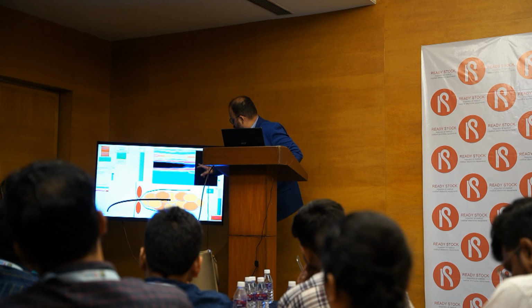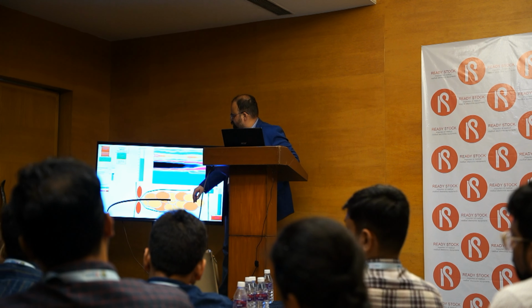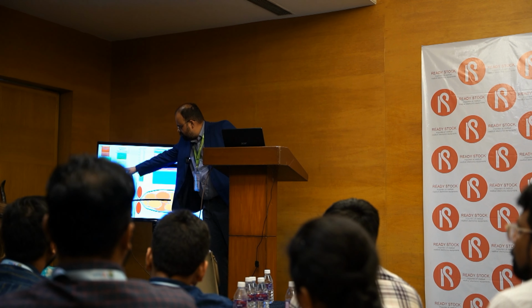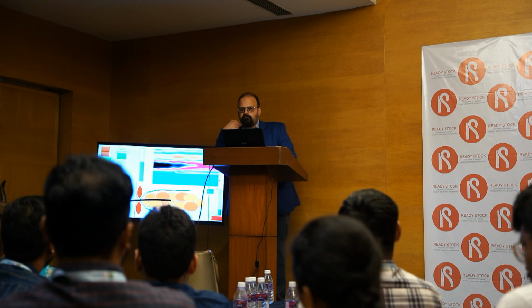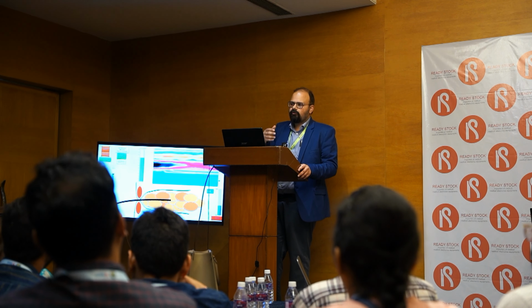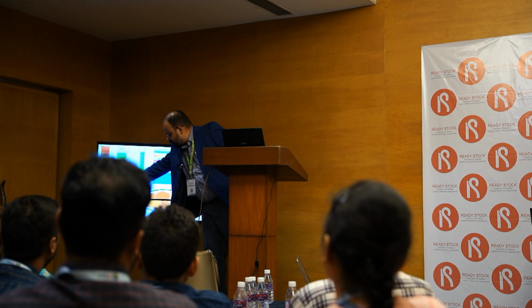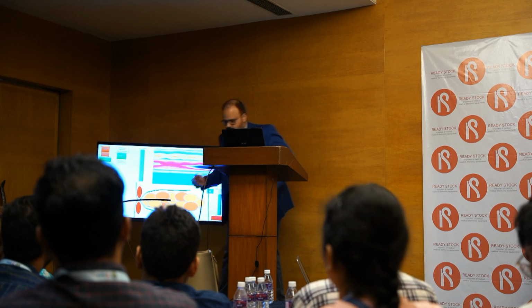You can define the anal canal from this area, so the pressures are automatically chosen. You can either manually track, or you can ask the software to auto track the pressures. These 2 points are usually for the feedback. Either you give a visual feedback by looking at the screen, or you give an auditory feedback, you tell them and they will learn it. And finally, these are the pressures which are there. 120, so this is the maximum. This is the minimum, and this is where you don't want it to come too low.